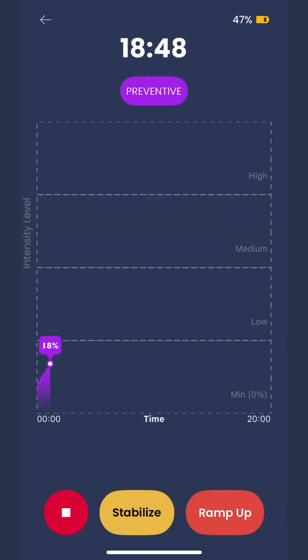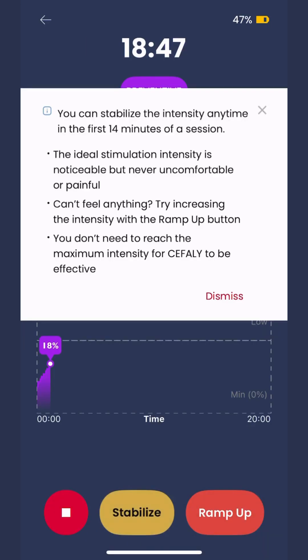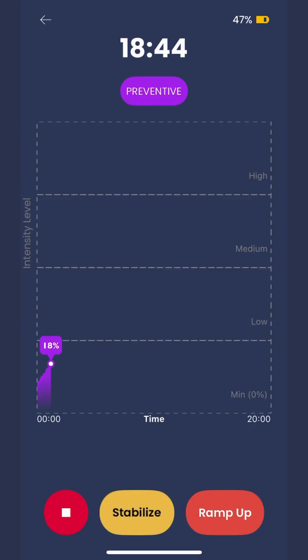Don't forget to stabilize the intensity at a level that's comfortable. If you need help finding your sweet spot intensity level, don't hesitate to book a free Cephali coach call where we can help.